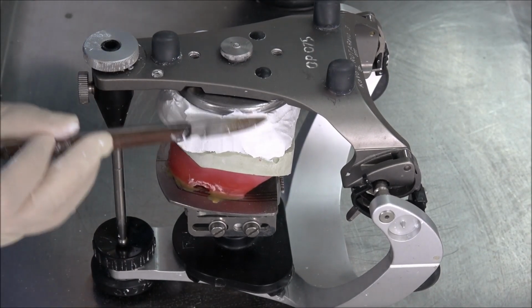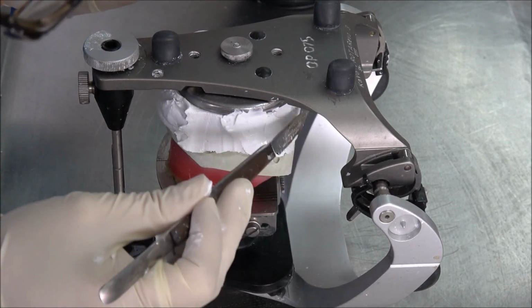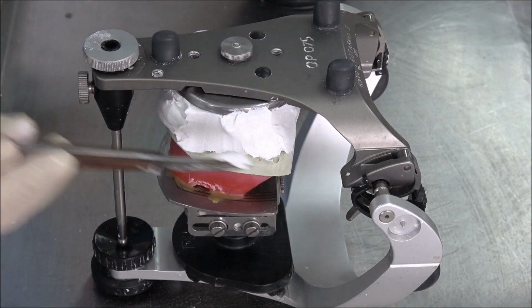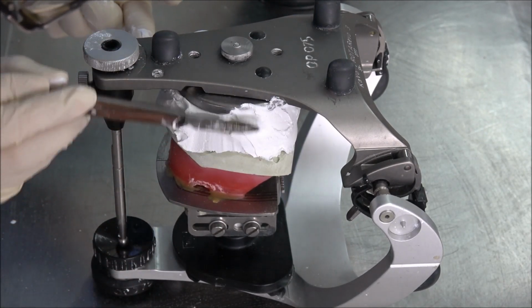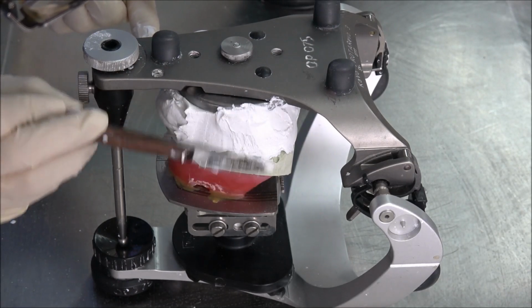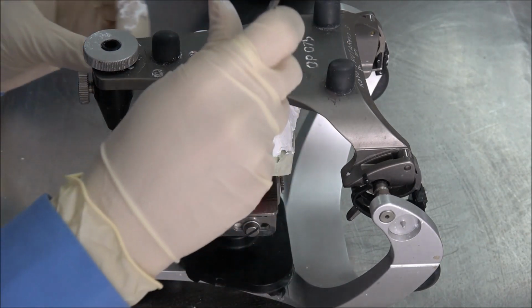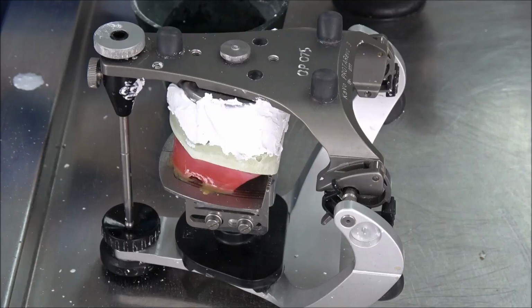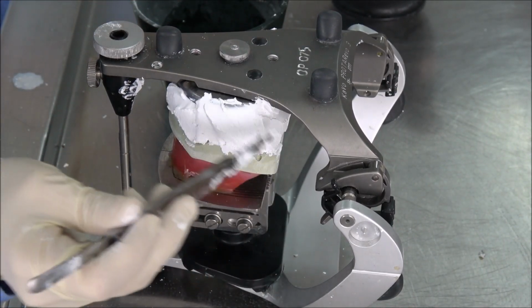We just remove the excess, and if there is any short part, we can add a little bit more. We can add on it and then make sure it's sealed. Make sure it sticks on properly. And we remove all the excess.